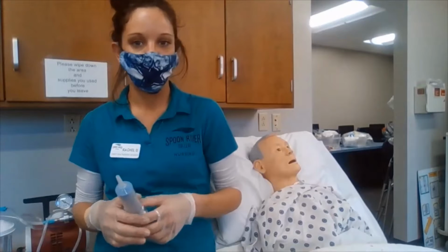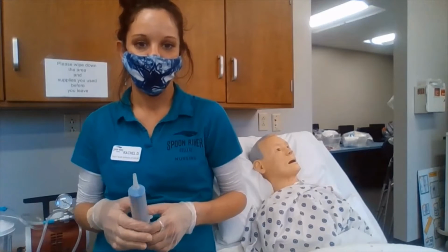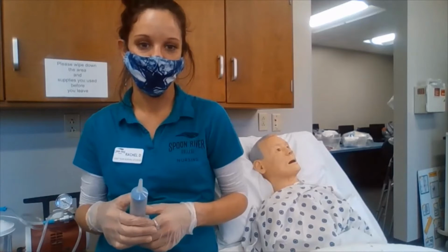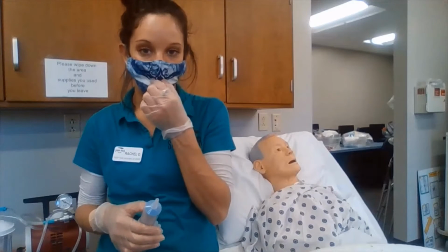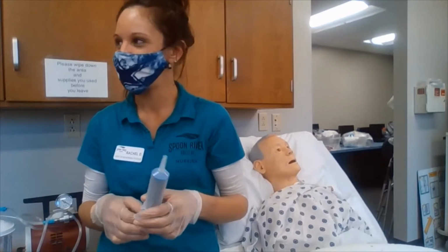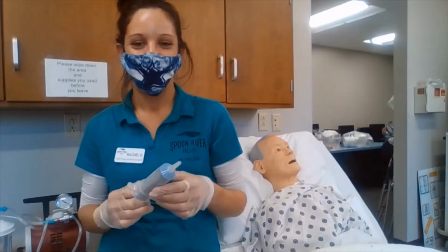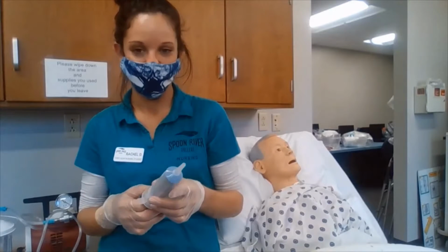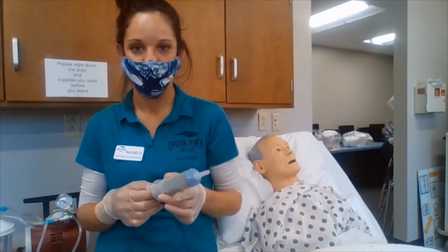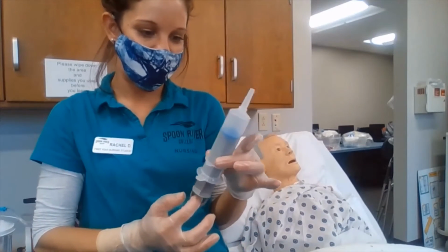We're going to make sure that we are giving our patient water with a straw, if they are able to swallow. We are also going to grab our Toomey syringe, and we are going to fill it with 5 to 30 milliliters of air. And there's our 30 milliliters of air.